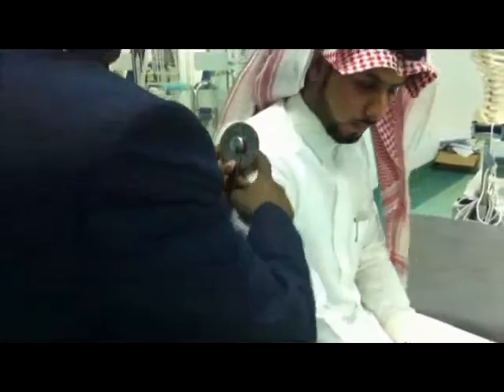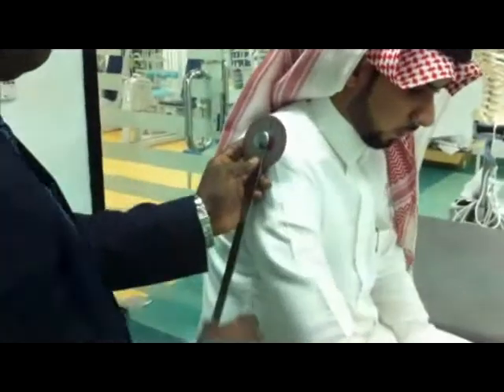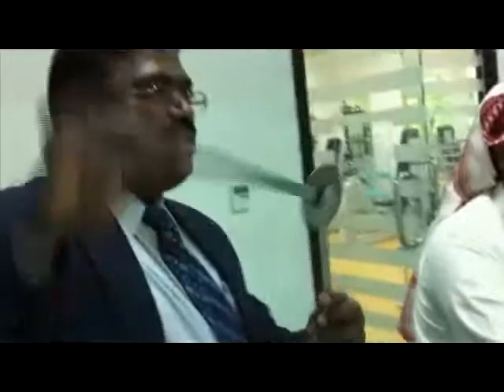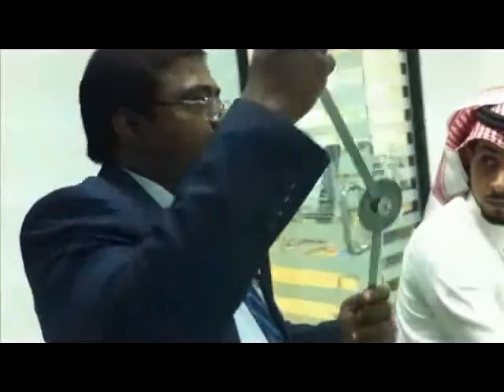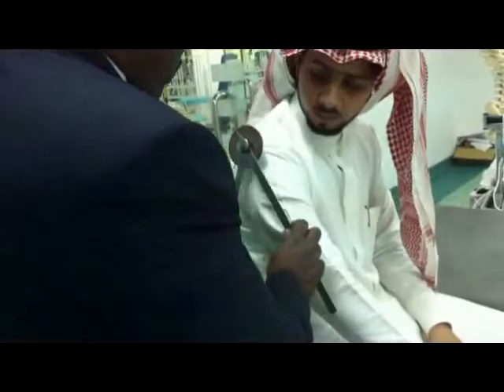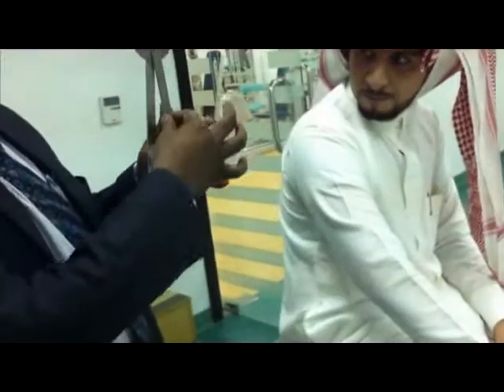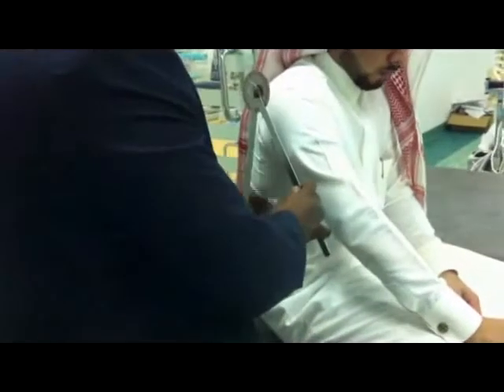Keep the fulcrum at the acromial process. The movable arm should be parallel to the arm, that is the humerus. The movable arm should be parallel to the humerus. The stationary arm is in the midline of the axilla — there is a midline on the trunk, so this should be on the mid-axillary line.